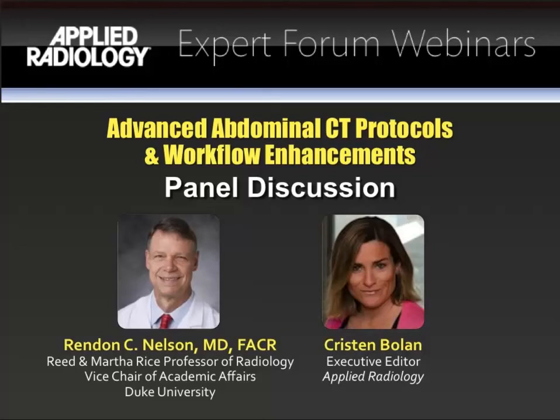What is your policy on wait times between readministration of contrast to the same patient for IV contrast studies on the same day? So that would really have to do with how much contrast media they received. In the old days, we used to give 60 grams of iodine routinely for certain liver applications, so I kind of keep that number in mind. I don't really like to give more than 60 grams of iodine to one patient in any one day. Typically we use in the order of 40 to 45 grams in our routine patients. If you're using a smaller dose, then you might have the opportunity to give a little bit more the second time. That's in terms of the dose.